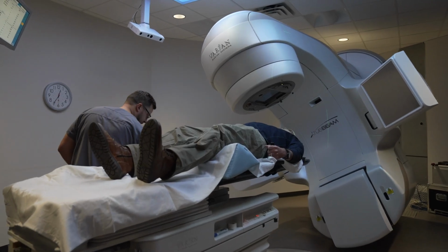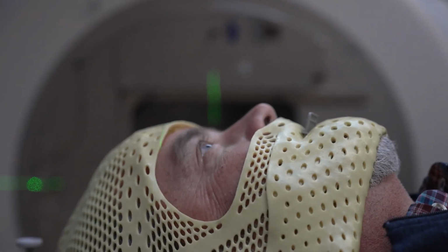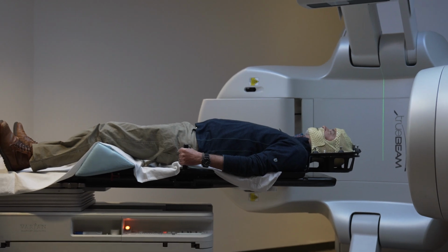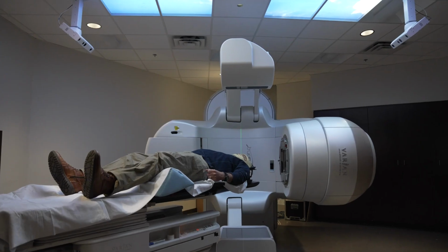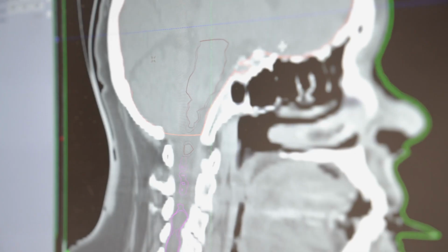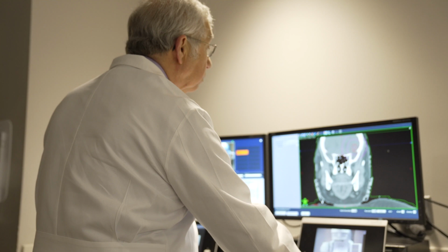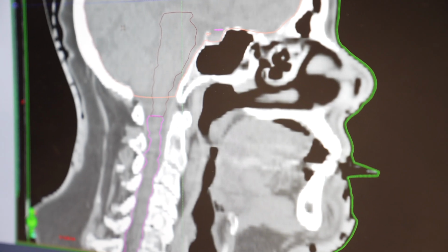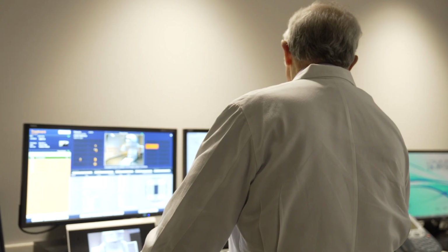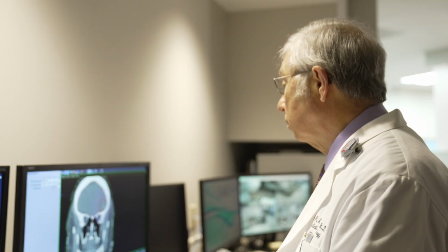It's specifically for treating brain tumors. And the time that it takes to treat the tumors is a lot less than with the regular equipment that they had before. So if you look back in the Cobalt days, the goal was to have a very uniform distribution of radiation from one side of the head to the other. It was very uniform. That was the theory and necessity with that technology. Now, we don't necessarily want to treat all those other areas of the brain to high dose. We want to keep the dose as low as possible.